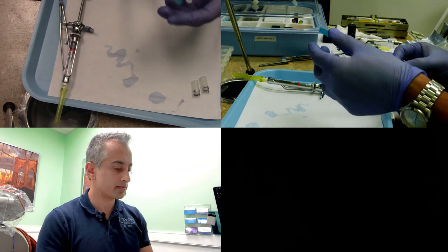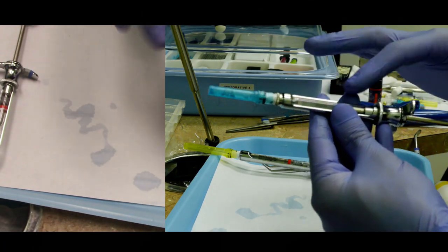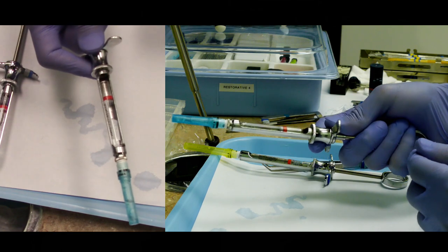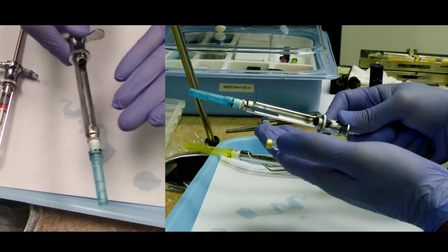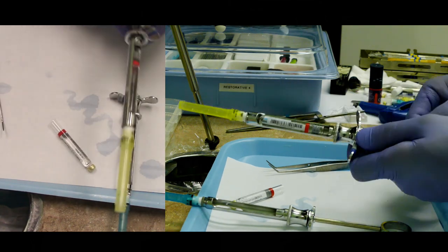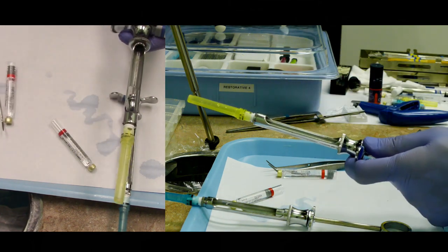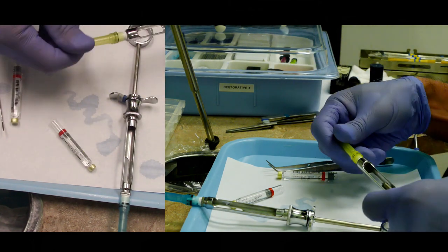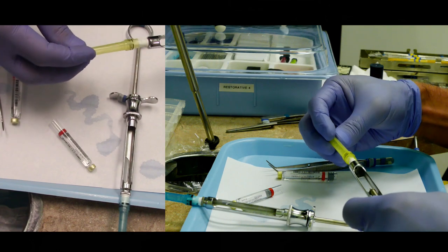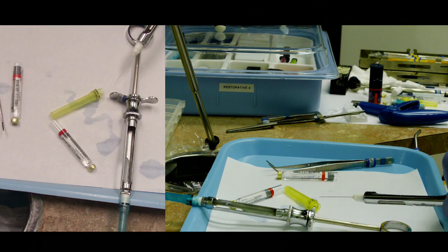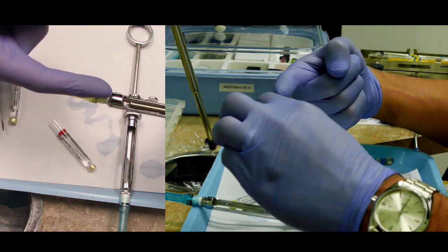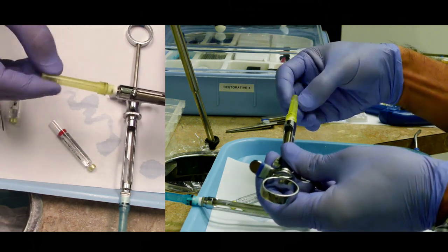When we disassemble this syringe, remember how we talked about that harpoon engaging? We have to twist that harpoon out of the plunger, pull all the way back, and pop that cartridge out. Now we have to unscrew our syringe top. Be careful—if you are unscrewing and you accidentally uncap it, drop the cap and use your scoop and cap technique to cap it again. As you're unscrewing, put pressure inwards to make sure that cap comes off with the needle.